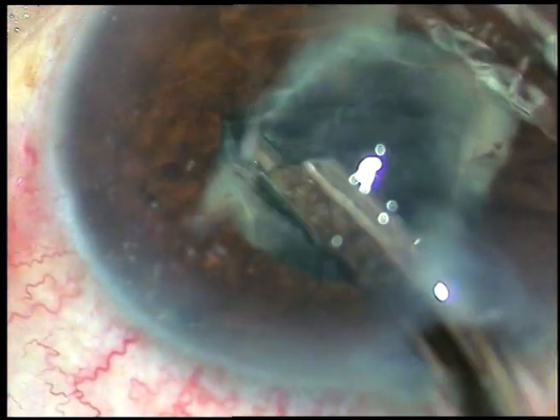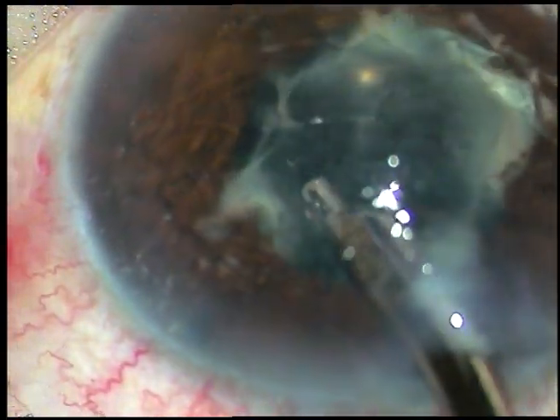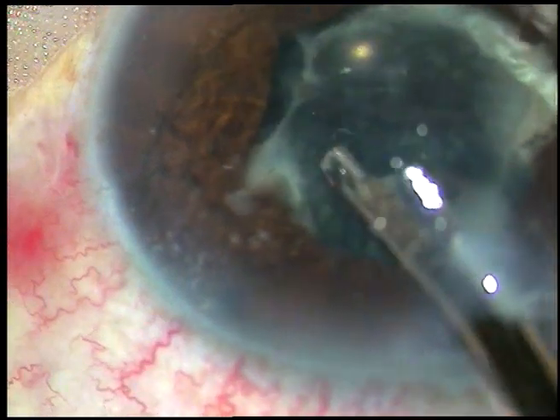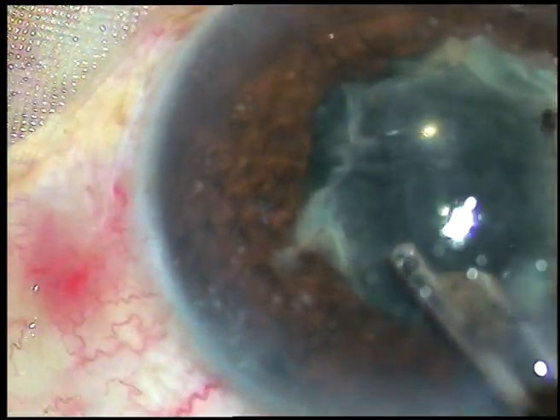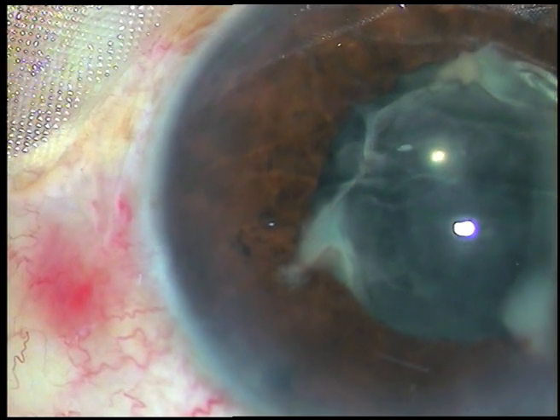Now see how thick the membrane is. It is not coming off — if I pull with the Simcoe, this is a 22-gauge Simcoe cannula, I could not remove it with the Simcoe cannula.